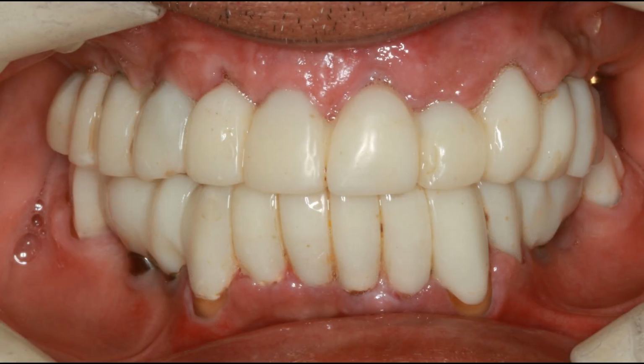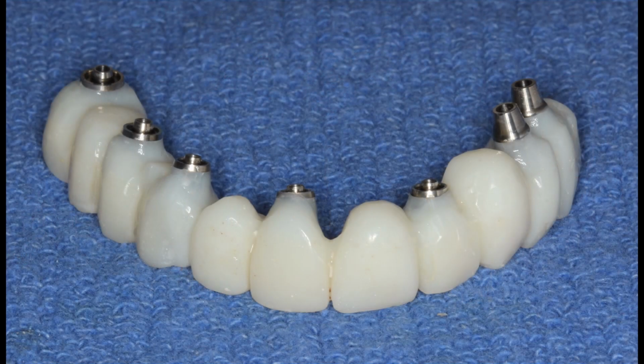So these are new temporaries that he began wearing after his first surgery. I'm sorry, after his second surgery, which was the bone grafting surgery. I want to just point out these are his third set of temporaries, and now all his implants are in there, and we're using the implants to support the temporary, same as I've shown you before with all the proper contours.